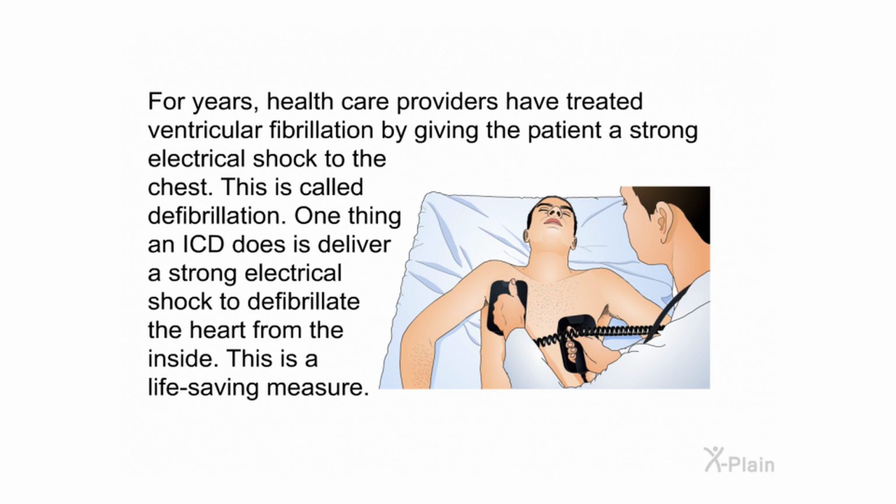For years, healthcare providers have treated ventricular fibrillation by giving the patient a strong electrical shock to the chest. This is called defibrillation. One thing an ICD does is deliver a strong electrical shock to defibrillate the heart from the inside. This is a life-saving measure.